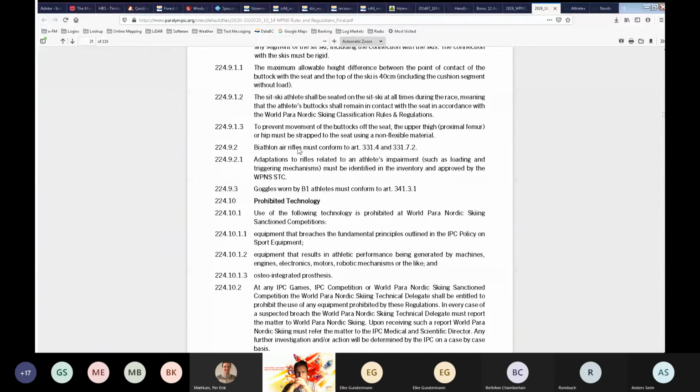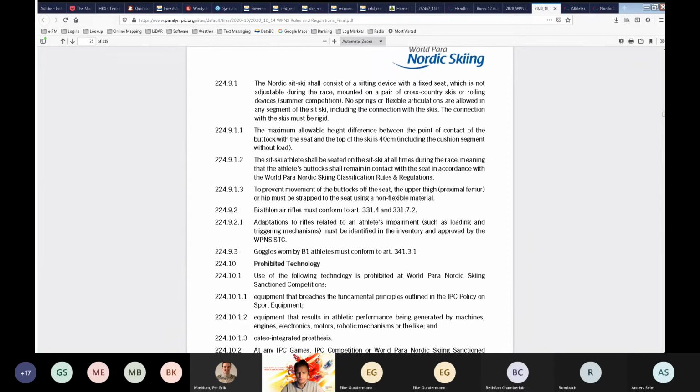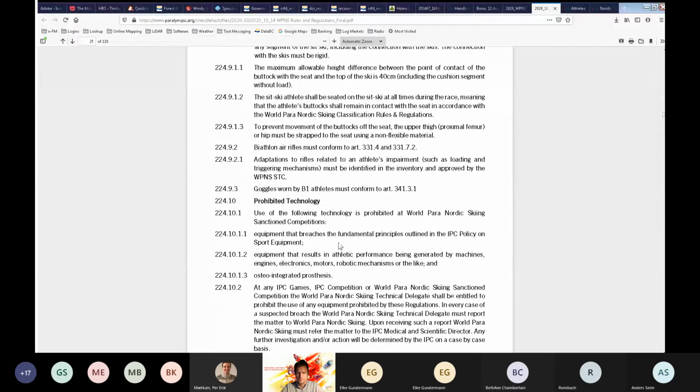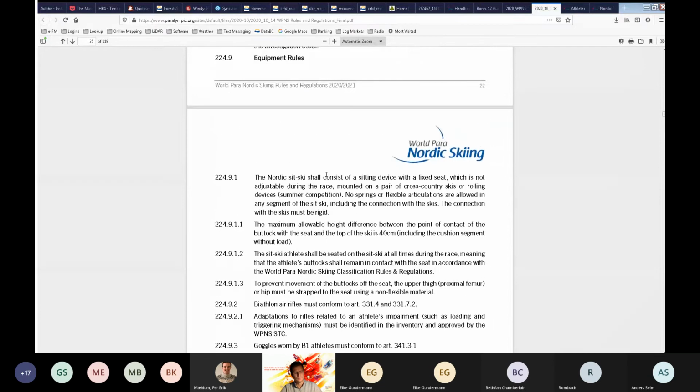So to prevent the movement of the buttocks off the seat, the upper thigh, okay, and this is defined as the proximal femur, or the hip, must be strapped to the seat using a non-flexible material. So this is also very important, that the seat belt is not flexible and that it's tight enough that the athlete cannot come up and down off of the seat during skiing. Okay, so those are the key rules related to the sit ski. You see there are also some other rules related to biathlon rifles and goggles that are in here, but we won't talk about those today. And then there's some additional references to prohibited technology and so forth.